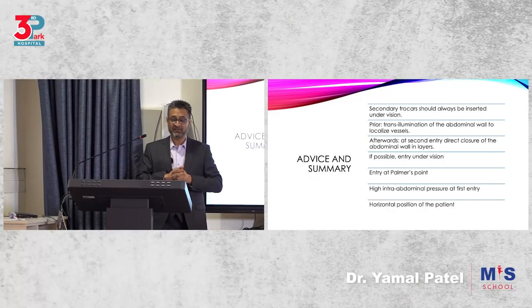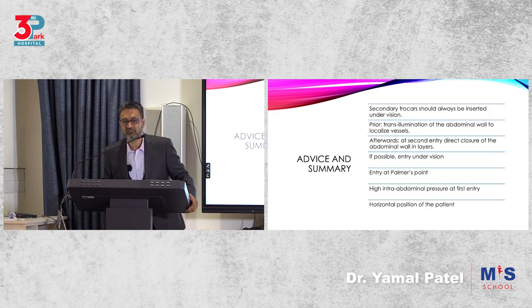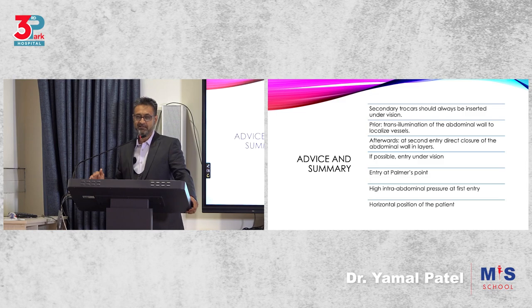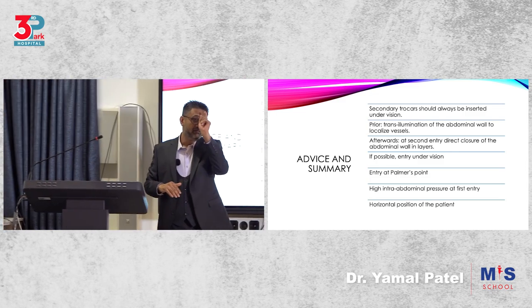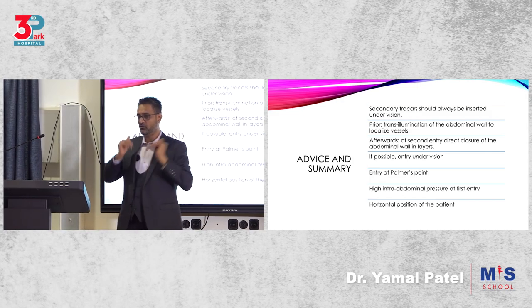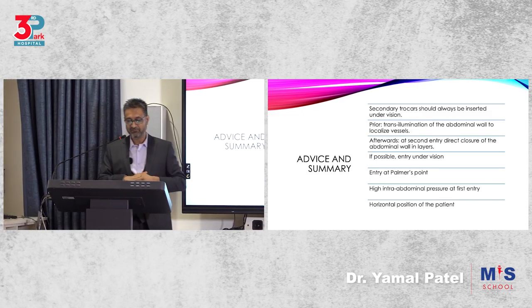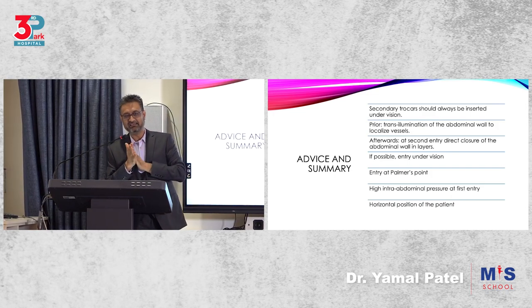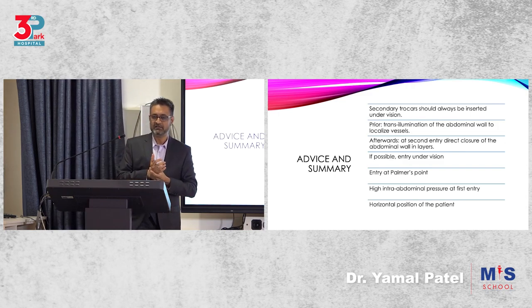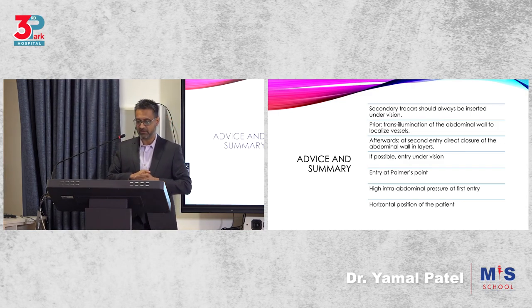Another piece of advice, so this is a summary of what is important. Secondary trocars: primary is going to be a blind entry. Secondary are always under vision, and you always keep the inferior epigastric under view when you're putting those in. You don't want to hit that inferior epigastric. Always try and stay away from it. If you hit it by mistake, it has caused mortalities because it's a very high pressure vessel arising from the external iliac artery.